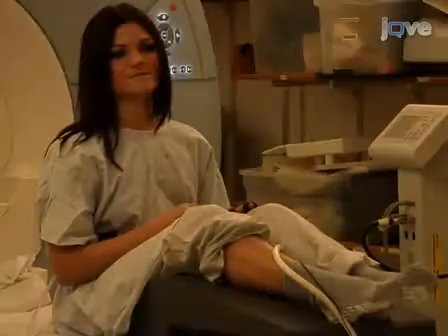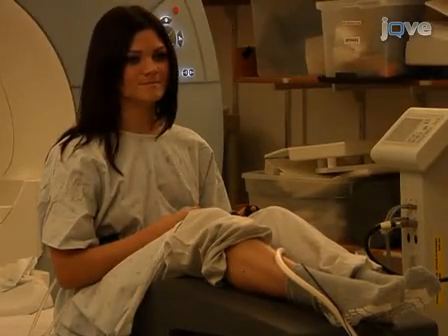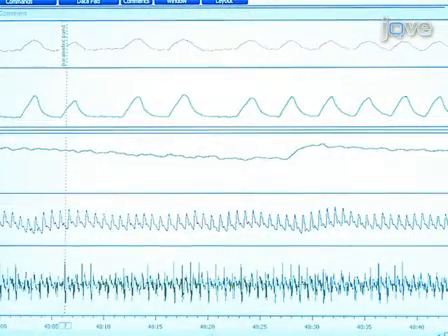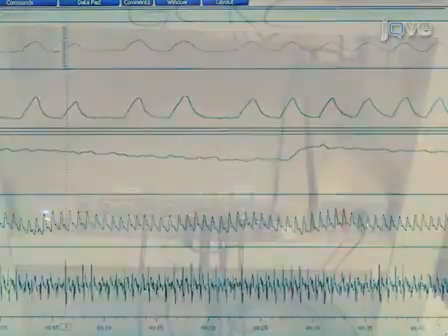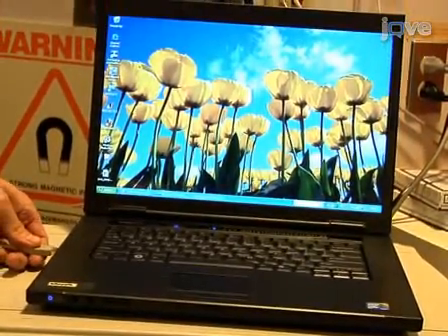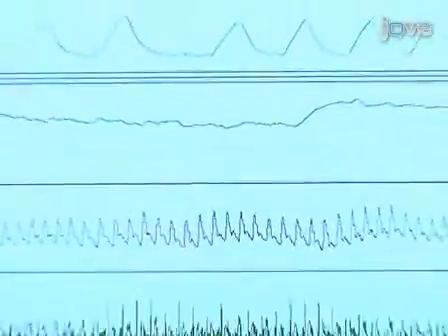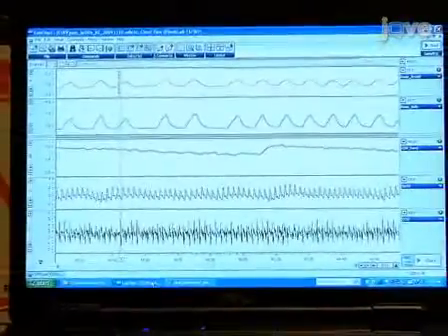During the scanning session, physiological parameters such as the electrocardiogram, or ECG, galvanic skin response, or SCR, and respiration are recorded from the subject. The signals are recorded with a PowerLab attached to a computer, equipped with LabChart software from ADInstruments, which amplifies, digitizes, and records the signals coming from the subject.